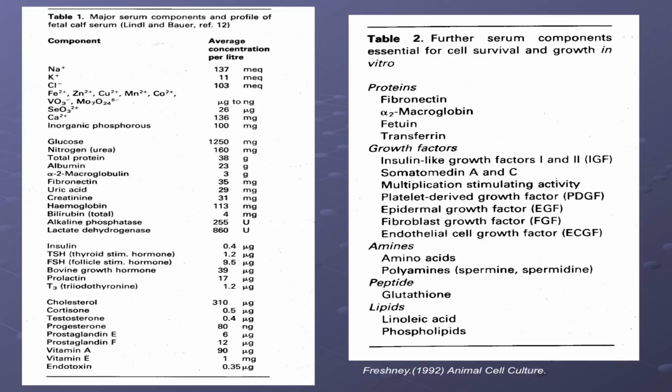After this is perfectly done, we have to keep it inside the incubator. Inside the incubator, the cells start to divide, and you will get the full monolayer by the very next day. So this is the regular protocol which is to be adopted.